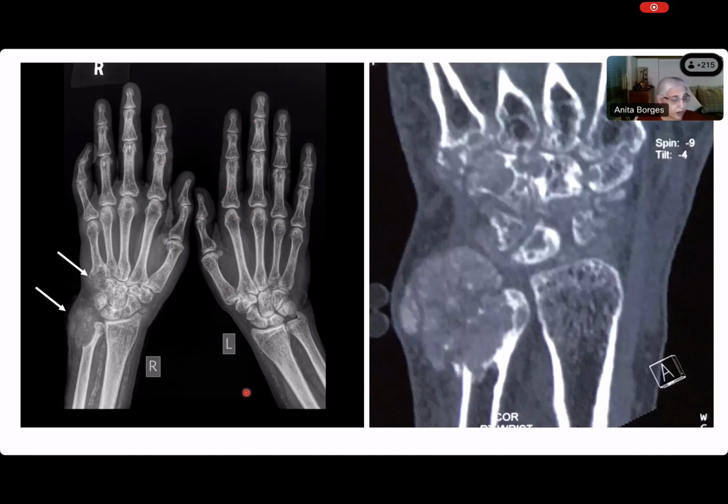Yes, ma'am. And all those who were not asked the questions. Okay, so that's where the cartilage is, and Mansi was absolutely right that this has fused on the left-hand side.